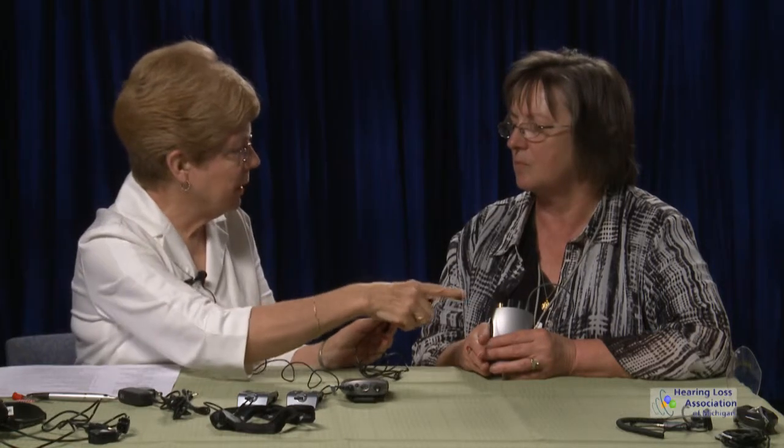What is the range on this environmental microphone? Do I need to worry about people rustling papers next to me? Okay. The environmental mic is going to pick up all kinds of sounds, and I can't really say the range because I think the range depends a great deal on your hearing ability. Some people do very well with the environmental mic, and other people don't. That's why I really like that you can use the directional mic again. You can unplug that, and use this particular one. But if you were to use this, even in a restaurant, you're going to hear silverware clinking against the plate, different things like that, if you don't have it close to the speaker's mouth. Go ahead. I can always just remove it. You can remove it. You don't have to use it with it in. Right. Got it. Okay? Any other questions? That's all.